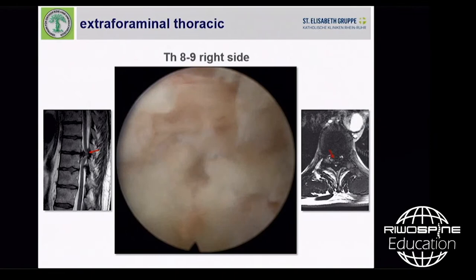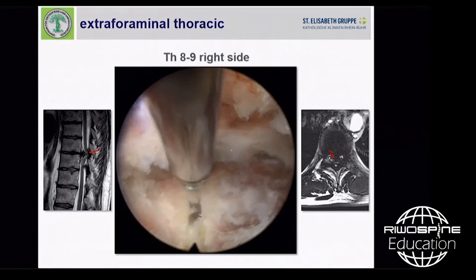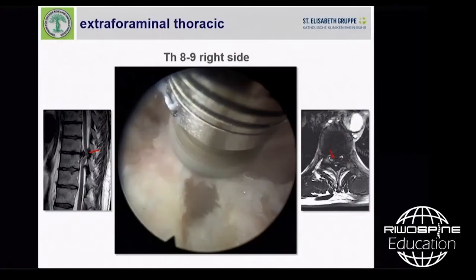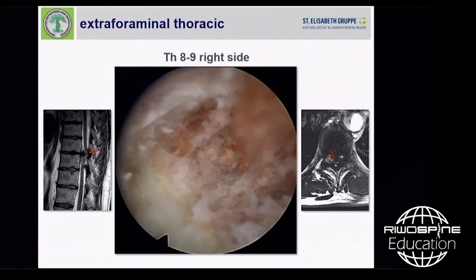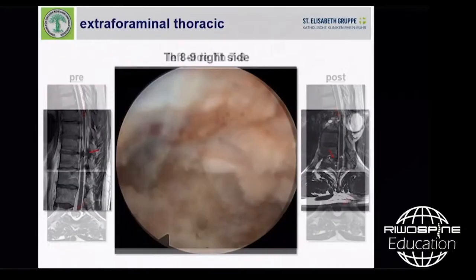So here we have to resect also bone in a box shape, like box-shape osteotomy. You know, that's an intervertebral space on right and left side. You resect the bone just in front of you until you reach the opposite side, and you perform a kind of indirect decompression. But in cases like that, you have to reach the opposite side. Now, that's a box-shaped osteotomy here, foramen. And there you see the thoracic myelon, and you have decompressed indirectly with this box-shaped osteotomy until you reach the opposite side. And again, you need this floating of the neural structures.